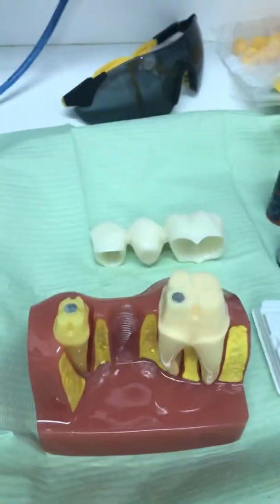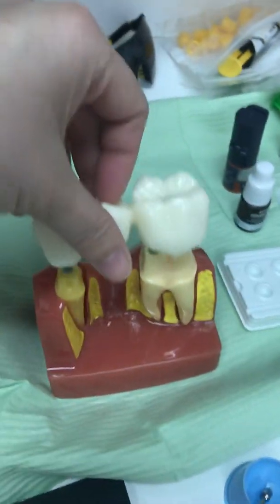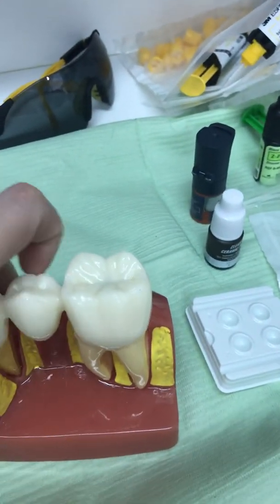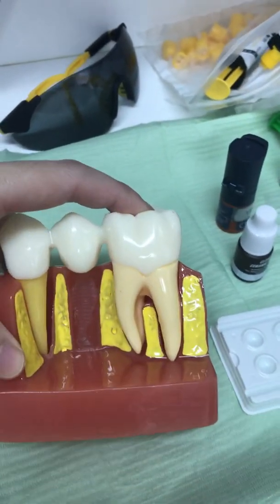After that, we will try the crown in, making sure the sides are fitting well. We generally take an x-ray — a PA or a bitewing — to make sure the fit on the sides is good.